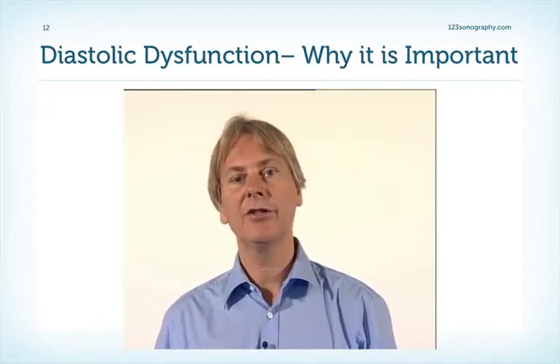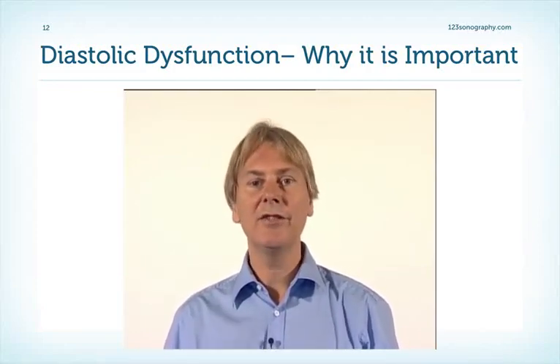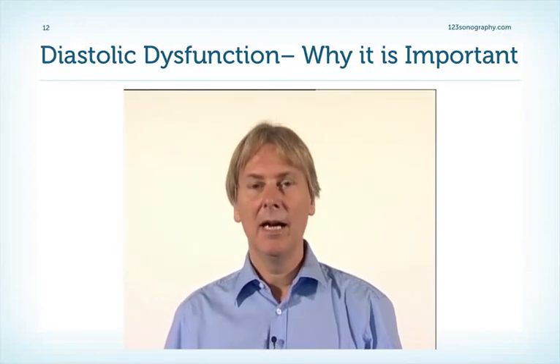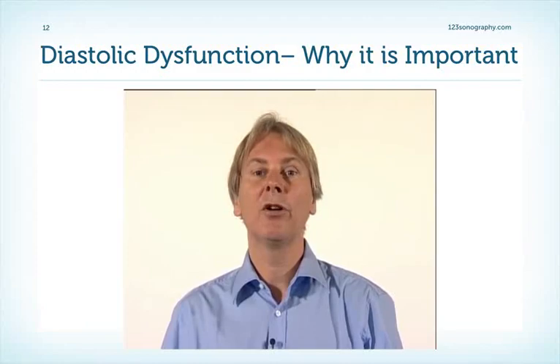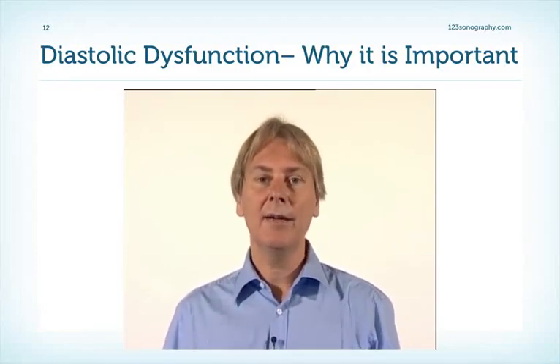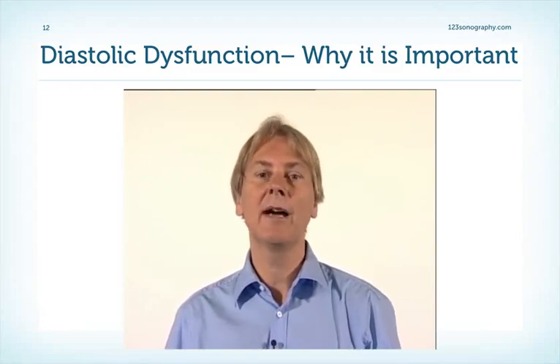Because diastolic dysfunction so nicely reflects the severity of symptoms and also the prognosis, it should obviously be performed in every pathology. However, because you might also detect the problem you might not see otherwise, it should be performed in all patients. Sometimes, with the help of diastolic function assessment, you might even detect the disease you might not see otherwise.